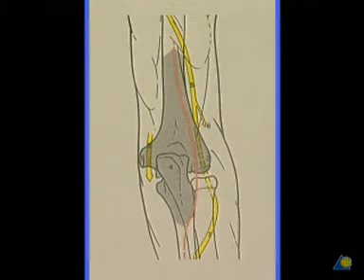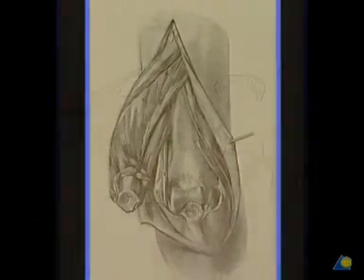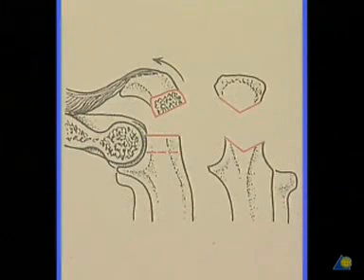The ulnar nerve must be identified, and it may be advisable to place an elastic sling around the gently mobilized nerve. To get good exposure of the articular fragments and to judge their accurate reduction, it is essential to perform an osteotomy of the olecranon, leaving the whole triceps muscle attached proximally. A chevron osteotomy is preferred to a transverse cut, facilitating reconstruction by tension band wiring.